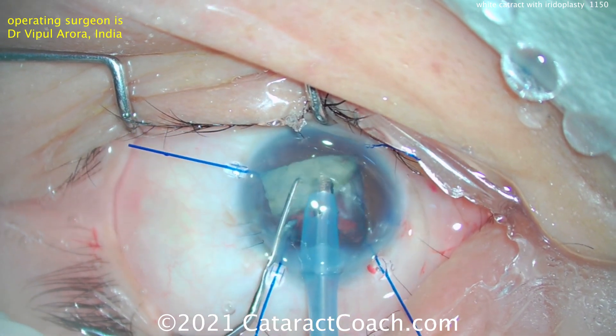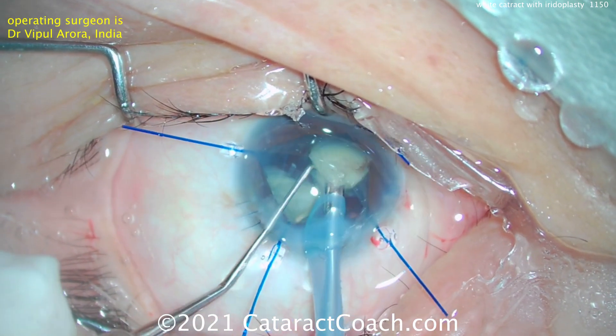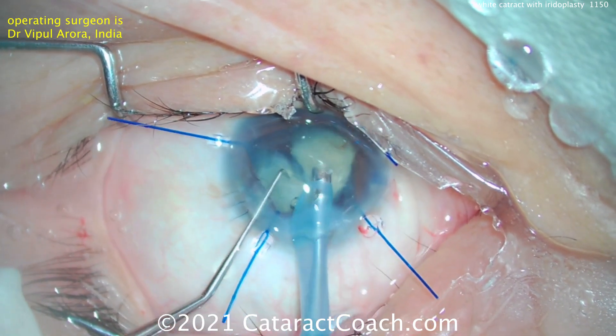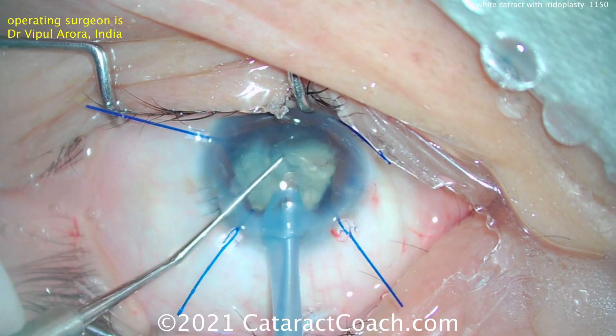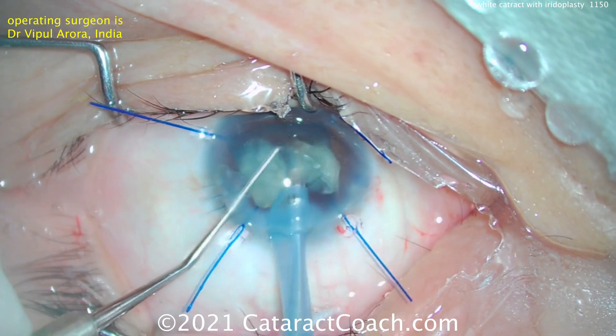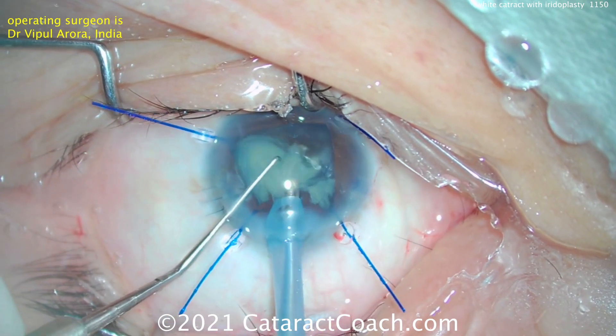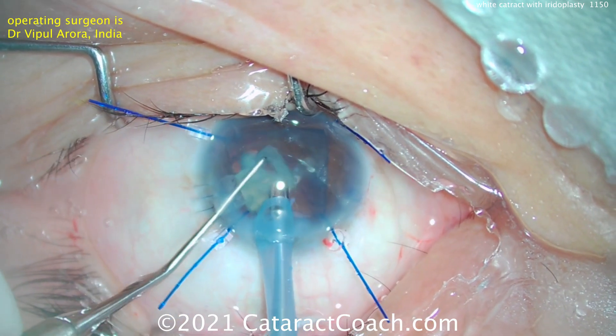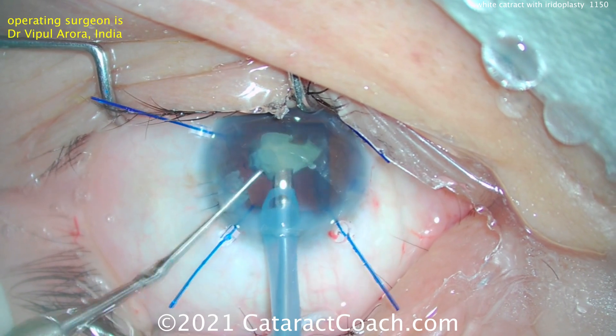This iris has been damaged sufficiently that you're really not going to have a whole lot of iris sphincter muscle left or any kind of pupillary reaction. So you want to choose an appropriate pupil size — probably about four millimeters is the sweet spot, maybe three and a half on the small side. As the last pieces of the lens come up, you can see them come up quite easily and quite nicely.